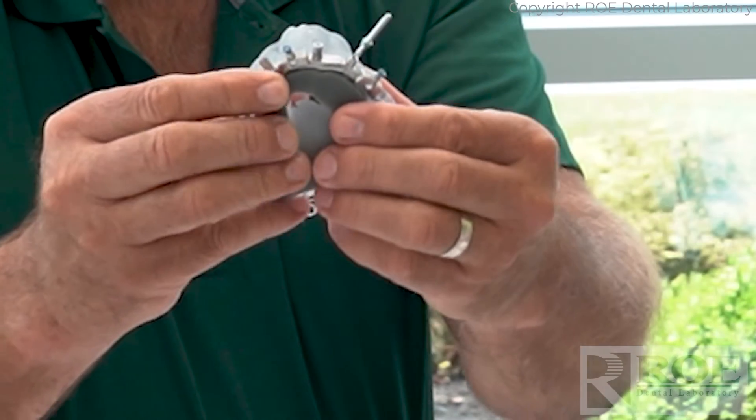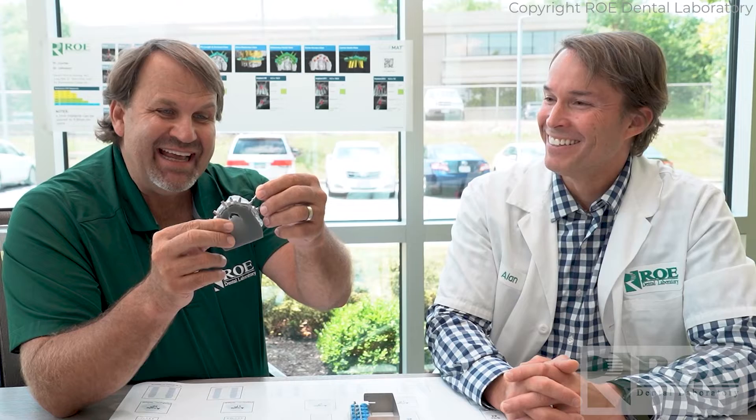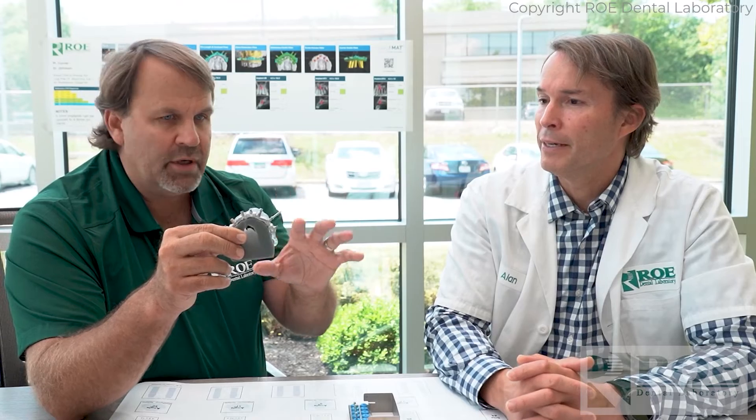Now we're going to use our drill — in this case it's a short roll, green — and go through the pin guide and drill through the fixation base. As for depth: drill through to just about two millimeters shy of that green line. The reason is that when you tap the fixation pin into that osteotomy site, you'll get primary stability on the palatal side. In the maxilla, stop short; in the mandible, you usually drill all the way through because you've got D1 bone.